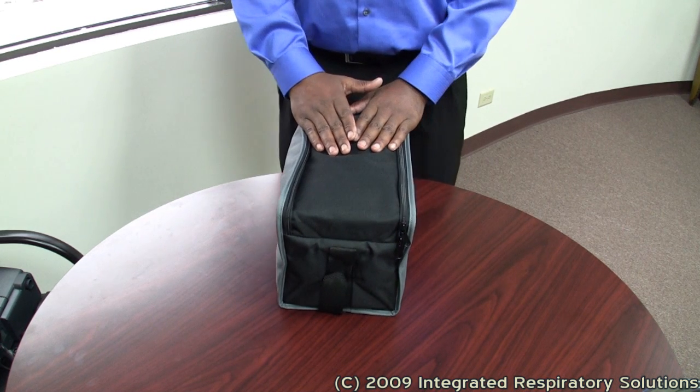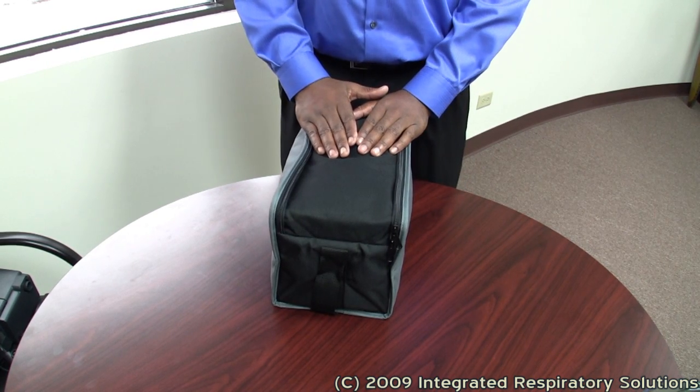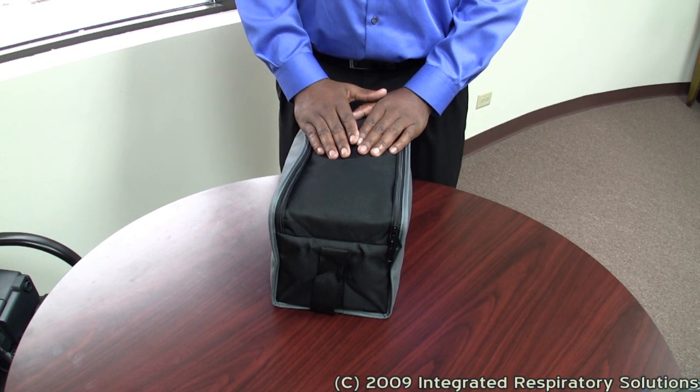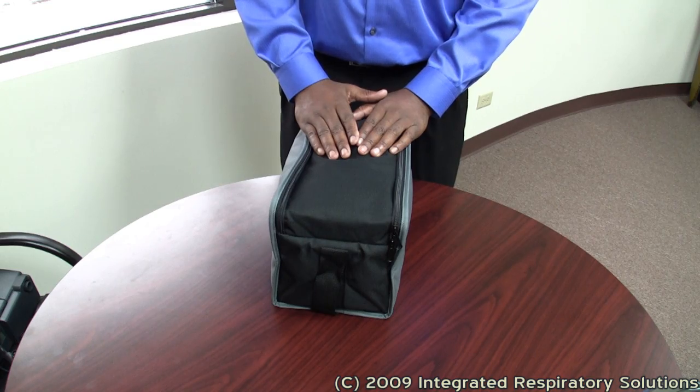Hi, my name is Byron. I am a respiratory therapist with Integrated Respiratory Solutions. Your doctor has recently ordered you a CPAP or BiPAP device. The purpose of this video is to show you the different components of the CPAP BiPAP device and how to assemble the equipment. Let's get started.